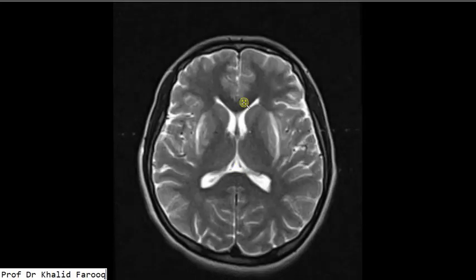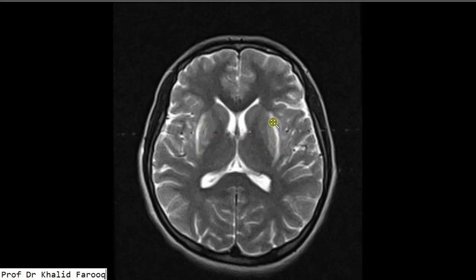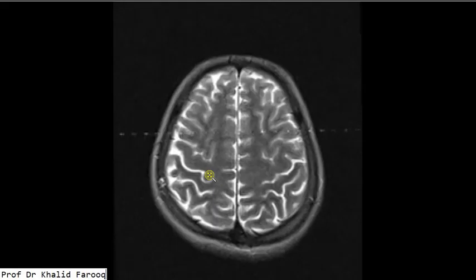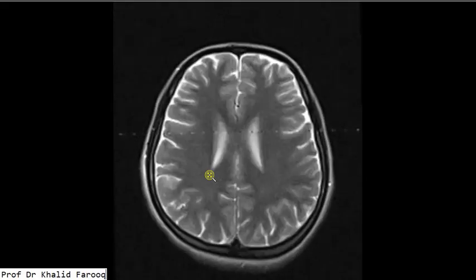Here we can see the midbrain, lateral and third ventricles, thalamus, and head of the caudate nucleus. Abnormal signals are noted in the basal ganglia on either side — that is, the globus pallidus and putamen — and both are almost symmetrical.